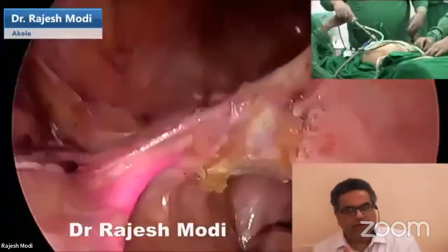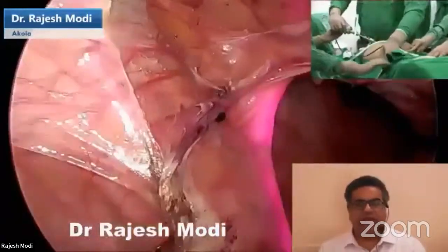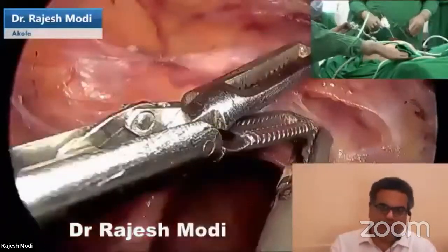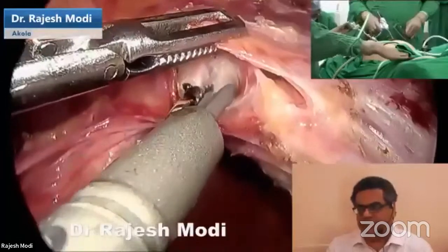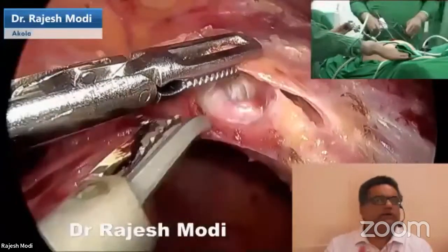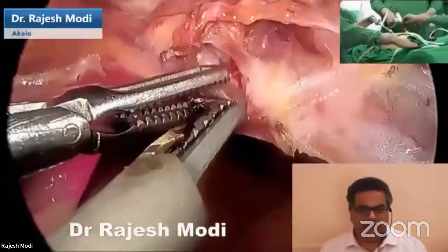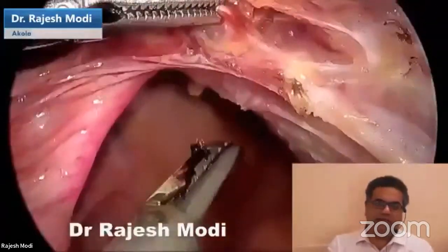So that 1 or 2 centimeter ureter falling back when I have separated the uterosacral makes a significant difference. The ureter actually goes out from your field of surgery when you are going to coagulate and cut off the uterine. So this is a dissection of the same transverse part of the uterine below the bladder pillar area. For me, this has become a routine to dissect the bladder pillar, identify the transverse part of the uterine, and then go ahead and coagulate at the level of the isthmus.